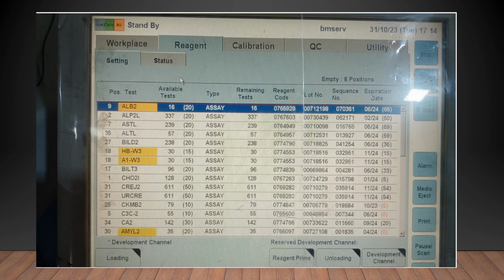You should not add another lot number, where, let us say, the other lot number is 00075 3195, like that. So what is going to happen, that will go for a new lot number and the instrument will ask for calibration, isn't it? But already this particular lot number will stay behind and its expiration date is also nearer. Because of that reason, you should always look at the lot number.